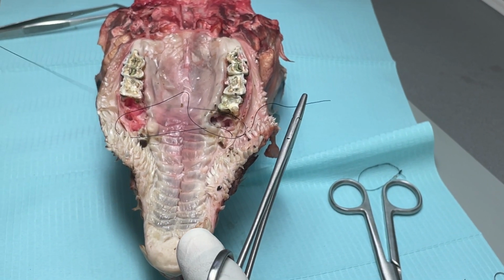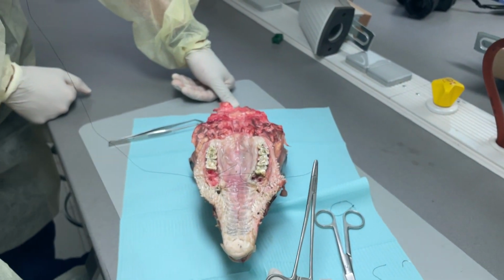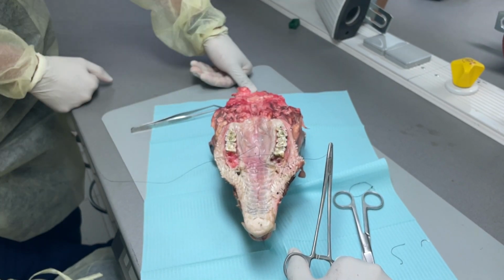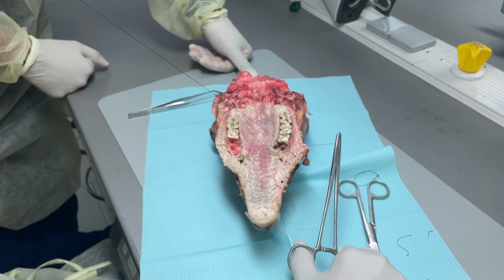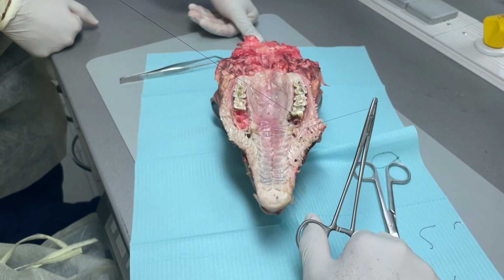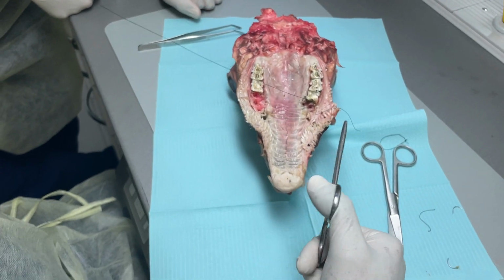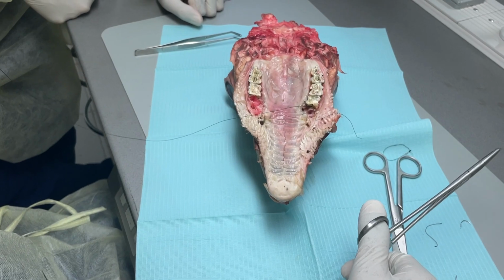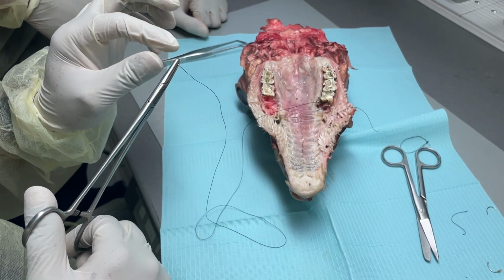See, whenever you're pulling this end, always make sure you grab the free end. Otherwise, what will happen? You will pull and this will come out. So keep this very safe. Now even if I pull, this doesn't go anywhere. If I release this, what will happen? When I'm pulling, this will come out. Then come across.